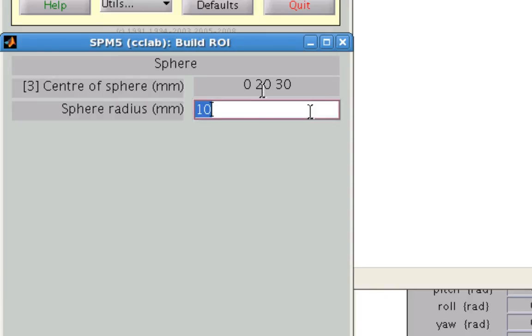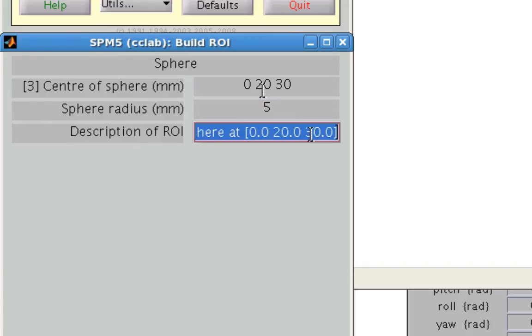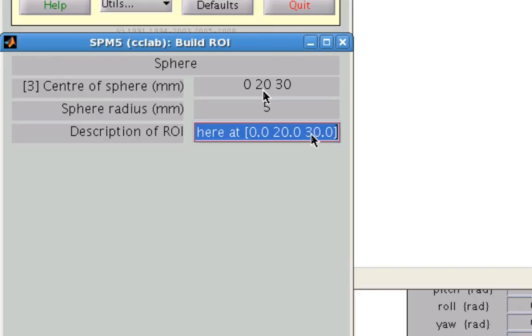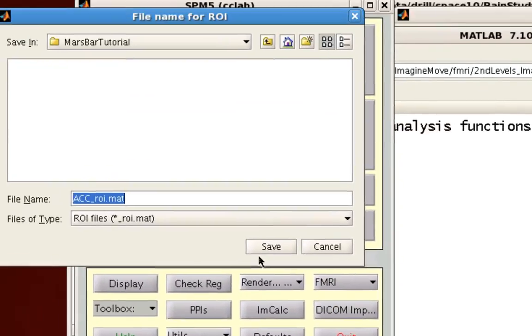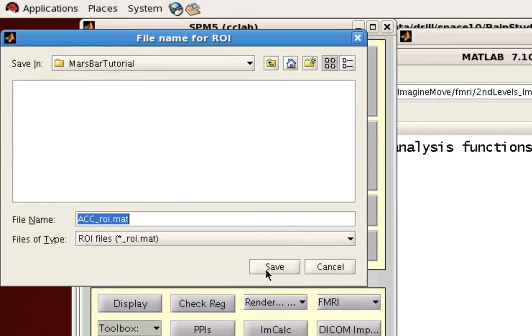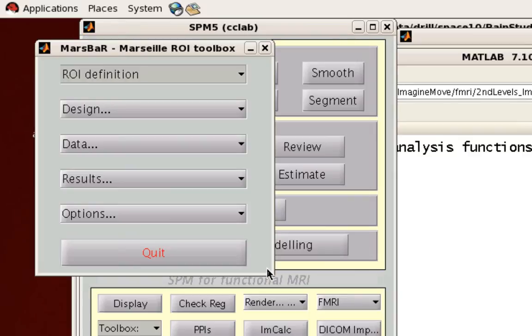Go ahead and click OK. And for a sphere, let's say we only want a sphere of 5 millimeters for this ROI. The description is usually fine as the default. That's for header information. And for the label, let's say, let's call this ACC. So go ahead and click that. And now you can save out this .mat file into the appropriate directory. So I'm going to go ahead and save that.